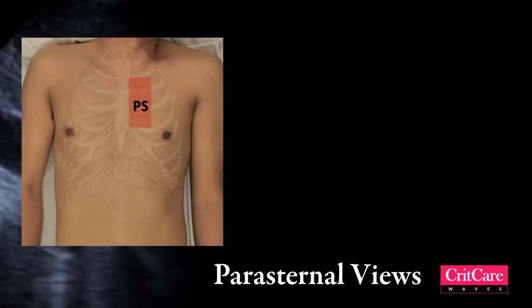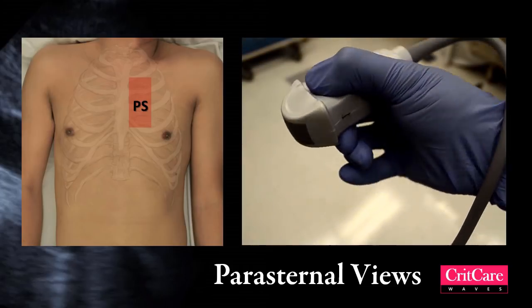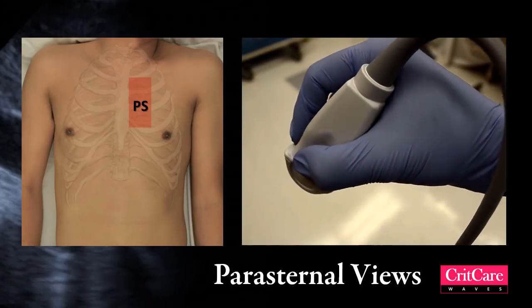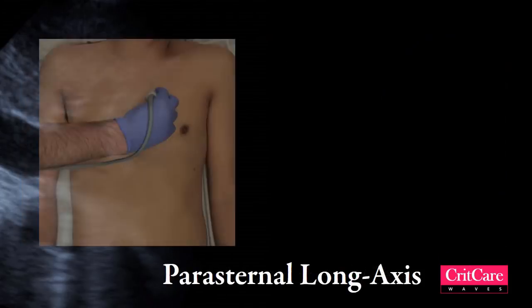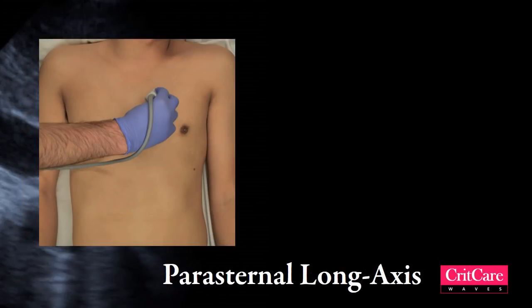To get the parasternal long axis, hold the probe as if you were holding a pencil. Place the probe in an intercostal space at the left sternal border, and have the orientation marker point approximately to the right shoulder. Since the ultrasound probe cannot see through bone, we will use the intercostal spaces as a window into the heart.